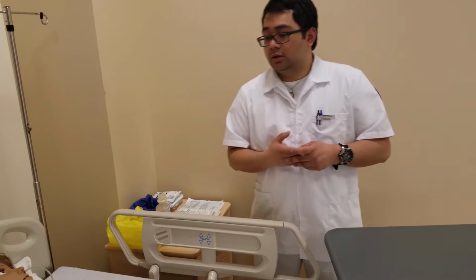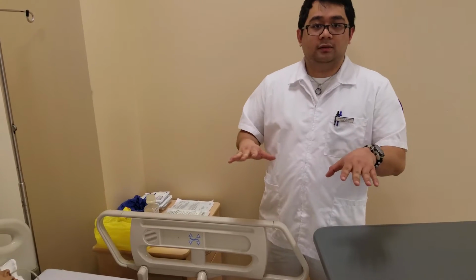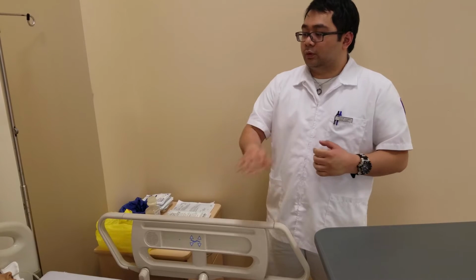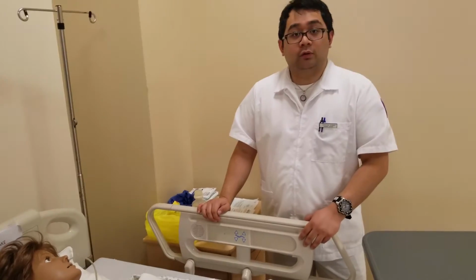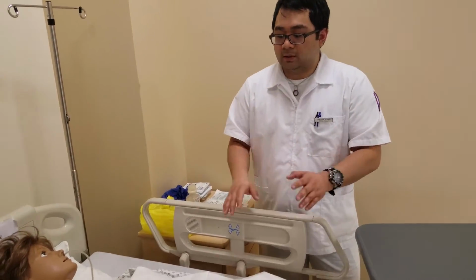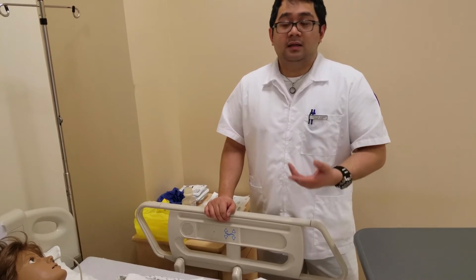Alright, so let's say we already did all of that, and instead of doing a clean dressing, it's going to be a sterile wet to dry dressing. So to start off, we're going to go to our patient and tell our patient that we're going to be doing a wet to dry dressing on her. It might be a little bit painful, so you want to ask if the patient is in any pain.